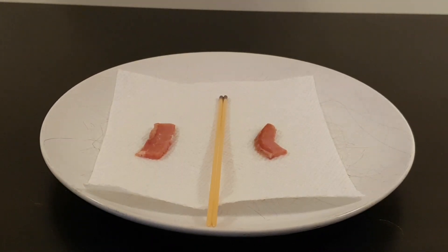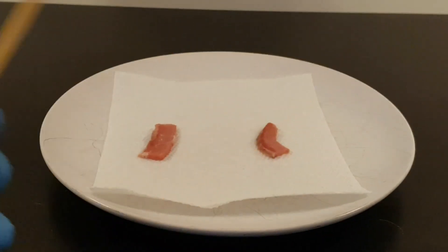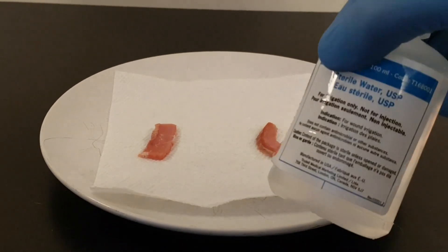This is a quick video on how to do silver nitrate. There are a couple ways of doing it, whichever way works well for you. You're going to need your sticks — I have bacon here — and then I've also got some saline and sterile water.